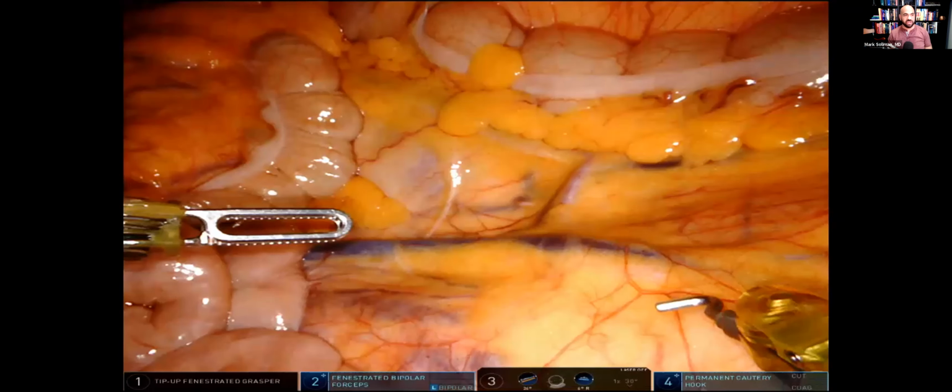All right, now here is my ballerina patient. She is amazing. So she had a kind of a nasty little sigmoid cancer, actually proximal sigmoid, distal sigmoid rather. And in this case, I'm showing this video purely to demonstrate what the anatomy looks like. We never get patients like this ever. So I'm going to show you a few more videos that show different types of anatomy and larger patients, and also videos that aren't even mine to help show this anatomy.